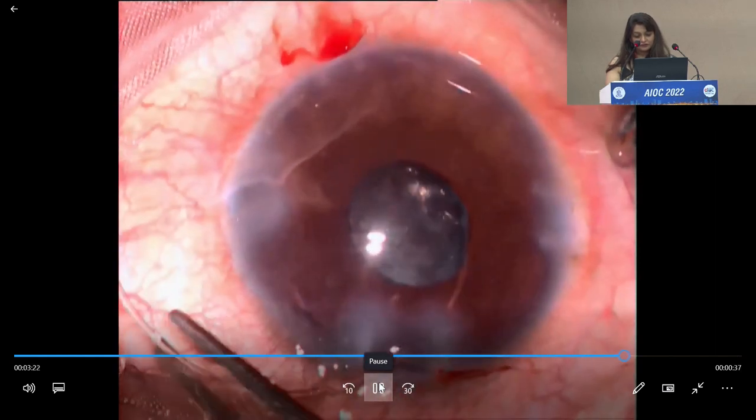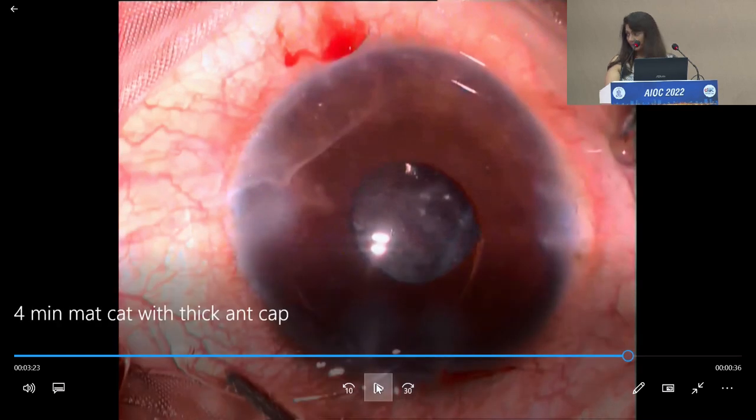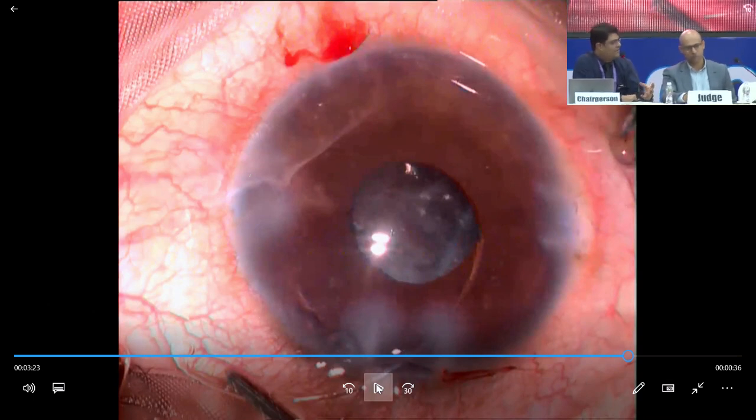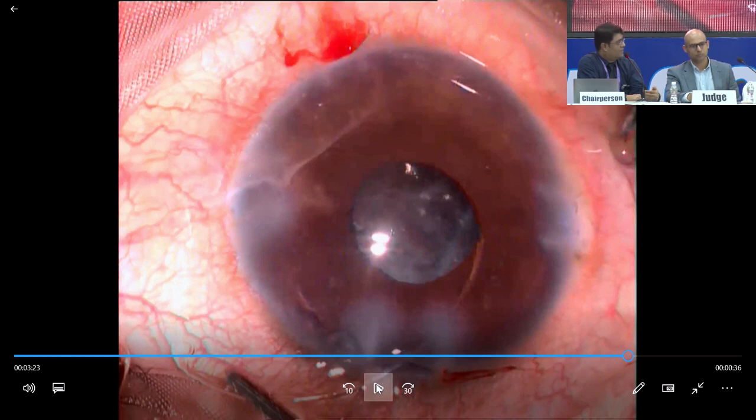Can you just pause it, Sheetal? I think this cataract was something very easy to chop. Had it been a grade 4, 5 harder cataract, which needed more time, I think you can also put iris hooks or a pupillary expander device secondarily. True. Everything becomes very easy because there is a small rexis. After putting that expander device, you can enlarge it and then do your phaco.